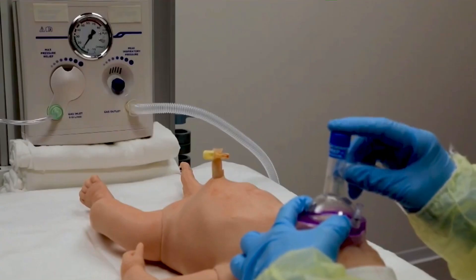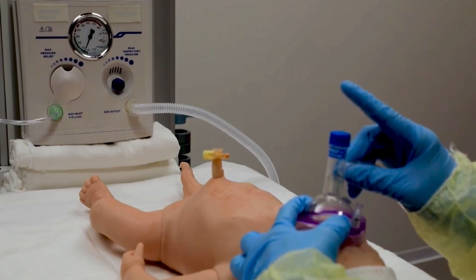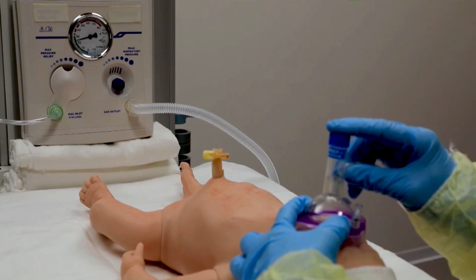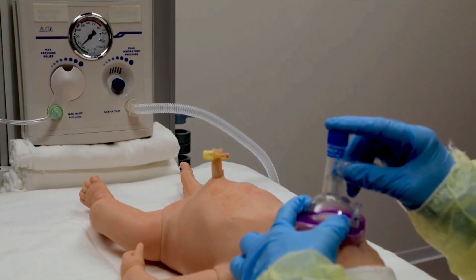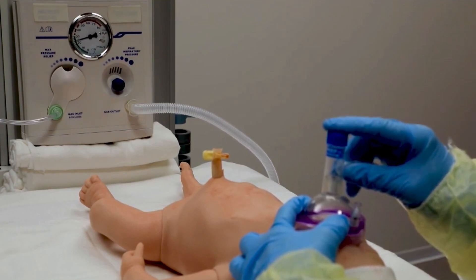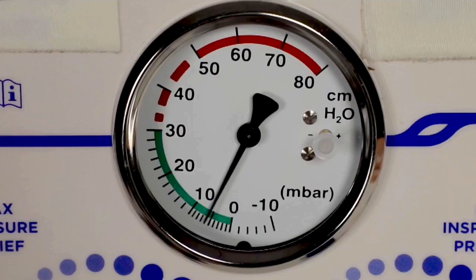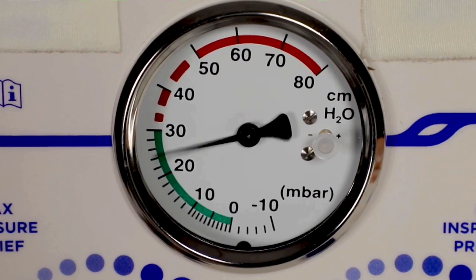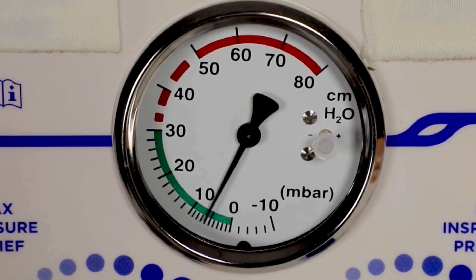It can be difficult to deliver PEEP with a self-inflating bag. The T-piece resuscitator delivers consistent inspiratory pressure and positive end expiratory pressure, or PEEP. PEEP helps achieve stable lung inflation, removes fluid, and prevents air spaces from collapsing during exhalation. Preterm babies especially benefit from PEEP during assisted ventilation. The suggested initial PEEP setting is 5 centimeters water.